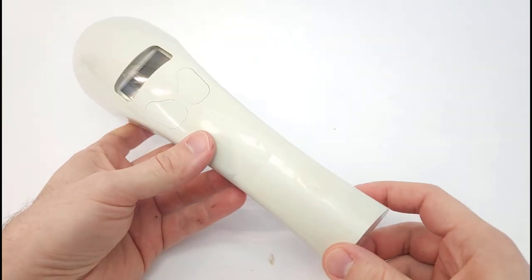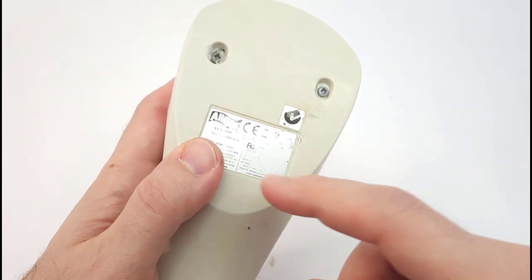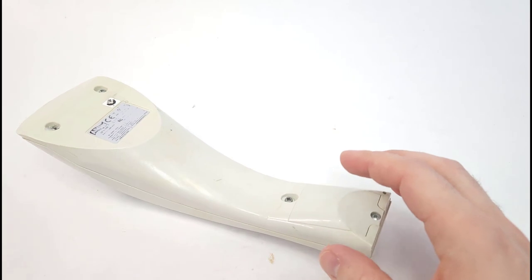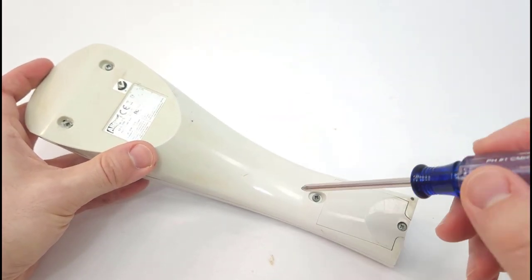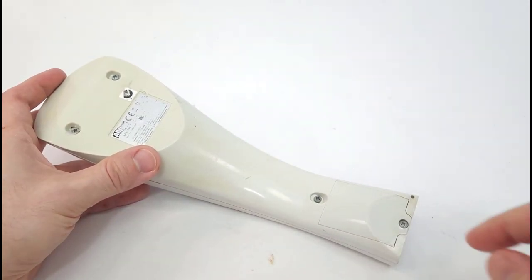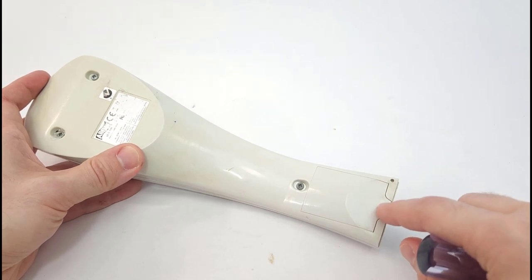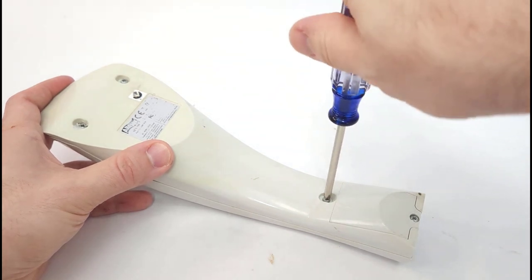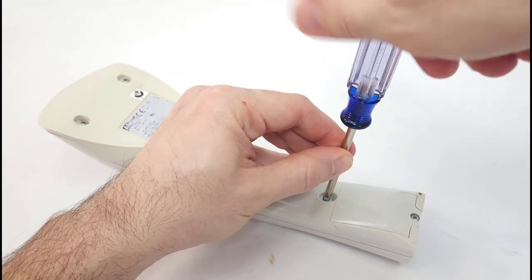To take it apart, flip it over, and I guess this might vary depending on the brand. This one is pretty worn out on the label here, but this is an Allflex, and I don't remember what the last one I did was, but the process was very similar. You are probably going to need a Phillips head screwdriver, and there will be some screws on the back you can take off to separate the two halves of the case. There might be an extra screw for the battery compartment, but you don't need to worry about that one. So I'm going to maybe speed up or cut through the video here as I take these three screws out instead of making you watch me do all three of them.